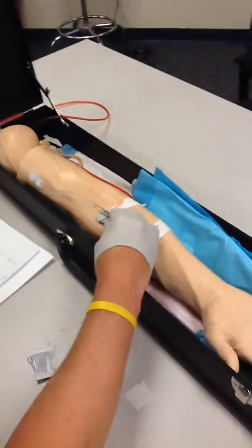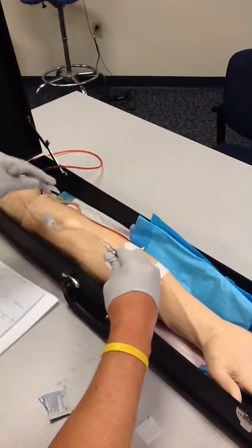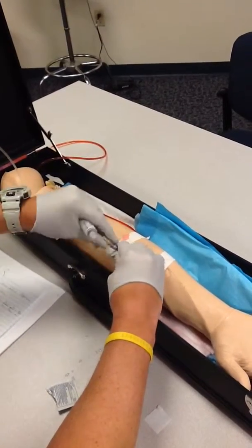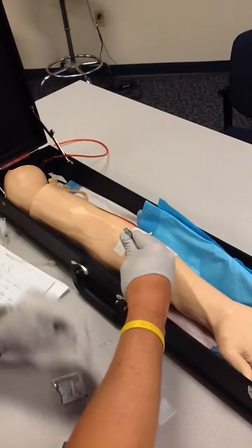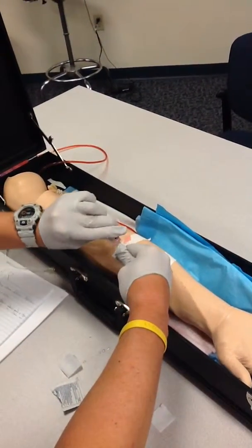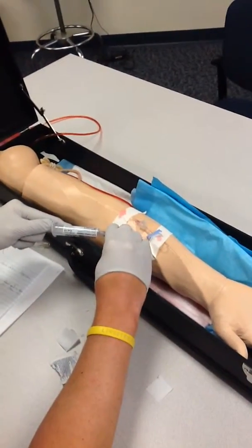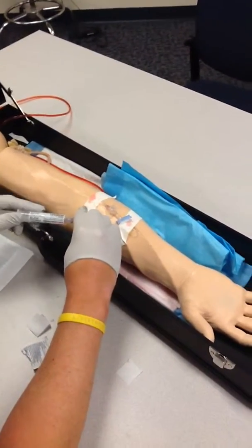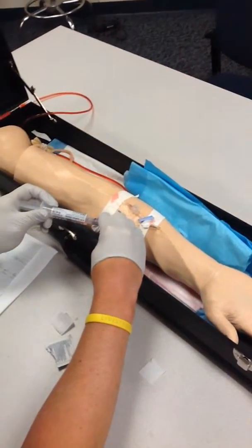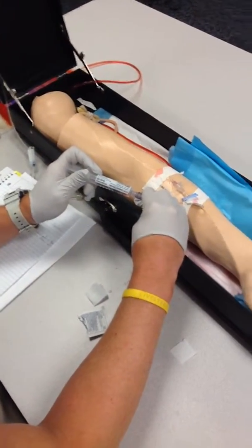I have another flush that I uncap. I make sure I stop any potential infusion. I remove the line. I have another alcohol swab that I will clean with just in case. Apply. And then I will check for return. Yes, we have a patent vein still, which is good to make sure we didn't infuse any into the interstitial tissue. I will push-stop as before, 3 milliliters.